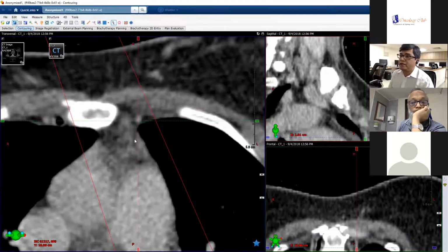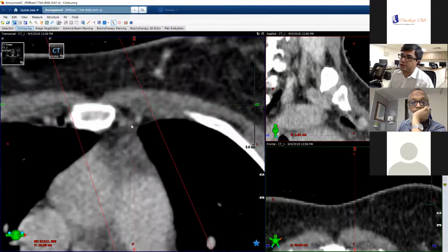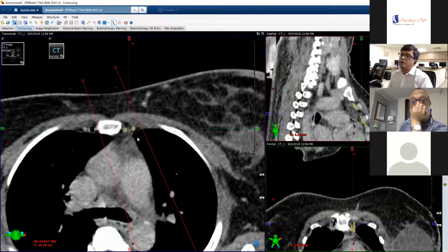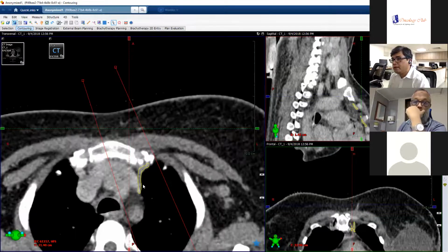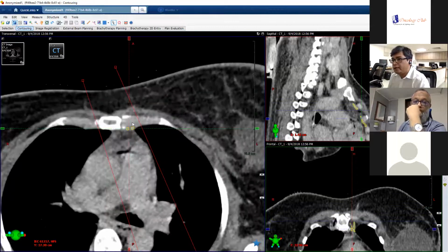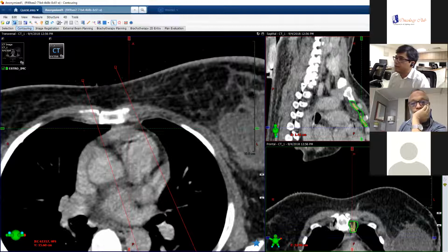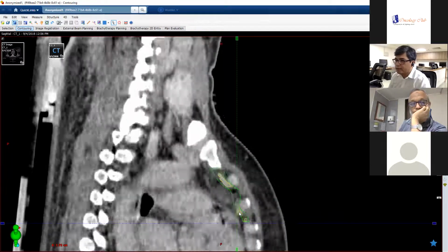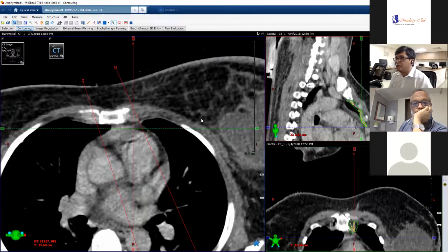It's easier to identify than someplace where there is not a lot of tissue attenuation happening. You can probably identify these two twin structures in the second or third intercostal space and take that as a reference and continue marking them either as separate structures or just combining them using a 3 millimeter brush and contour them cranially till your lower border of the ESTRO CTV and give them a margin of about 5 millimeters and then crop them from the lungs, crop them from going into the ribs, and what you will have is this. This volume will sort of protrude in between the ribs, will come out, but definitely will not go into the lungs and will definitely not go into the ribs. Can go into a little bit of the intercostal muscles, but this will be combined with your breast CTV.